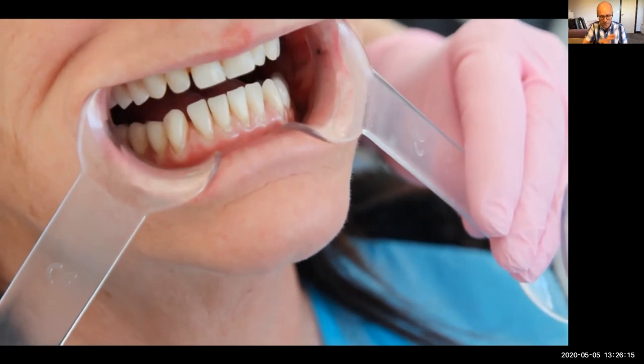This is a very, very important thing, because often patients will think that if they're getting implants, then the teeth will be as solid and as robust as natural teeth. But that just is not the case with 2 lower implants. It always pivots. So it will help keep them nice and stable and secure, but they will still rock.